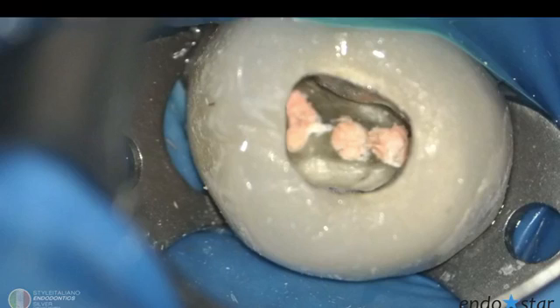He said, I had lots of problems with this case, and I searched for canals. In the middle, I didn't find the canal, etc. So I'm sending you the case. I want to remove the bridge, but first try to do the endo through the bridge. So this is when I opened the access cavity.